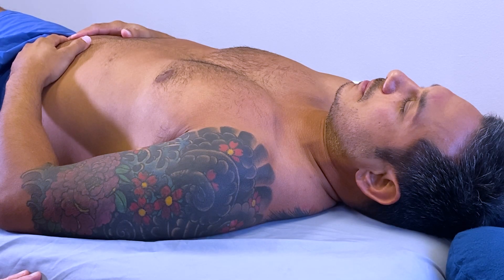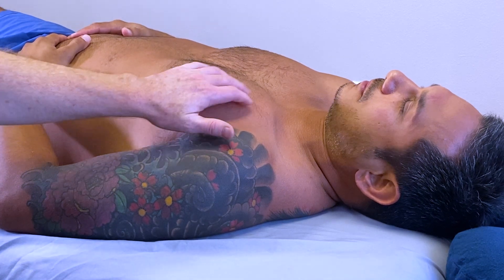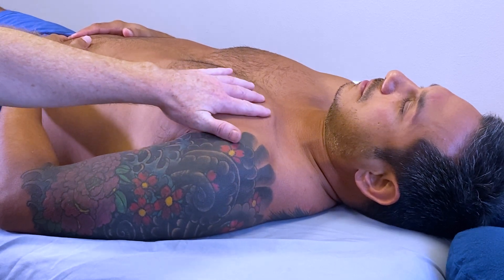We're going to look at palpation for taut bands within the pectoralis major muscle, and we'll look at a way of needling this muscle safely. First, let's identify the fiber direction for the various portions of this muscle.